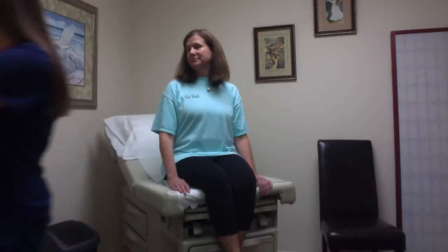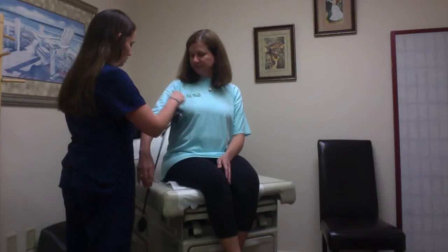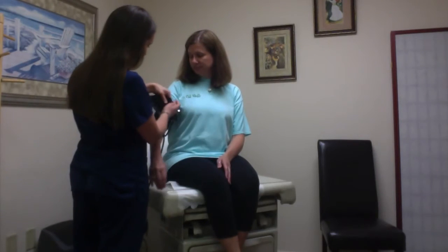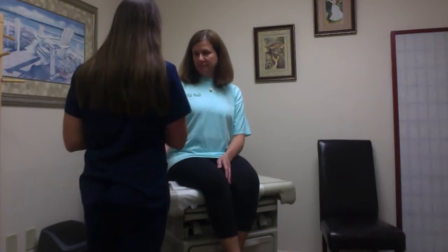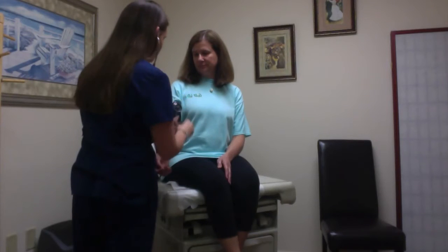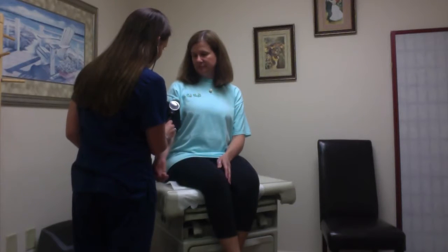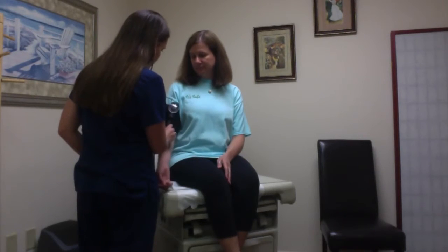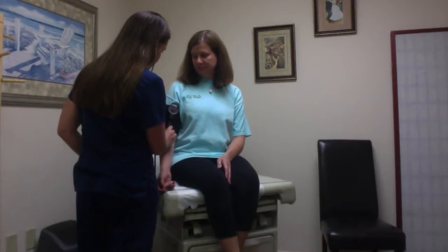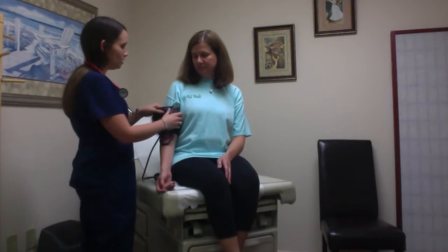I'll start by taking her blood pressure. Let's see. So I will locate her brachial pulse and then make sure it lines up there. So her blood pressure is 118/72, which is a very good blood pressure.